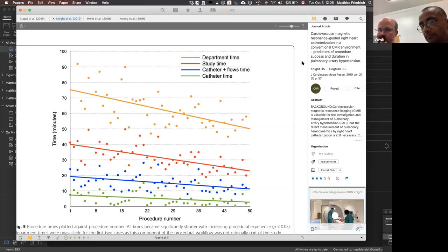So then looking a bit forward, Timo, one question I had for you is, 3T environment, while as you said it may provide more spatial resolution, of course you deal with way more artifacts. So that didn't deter you from doing that, or have you ever done some work on 1.5 and compared that?